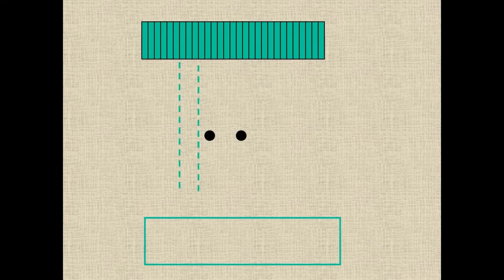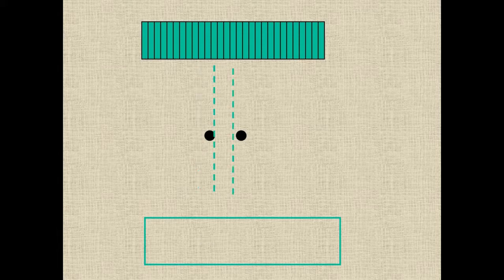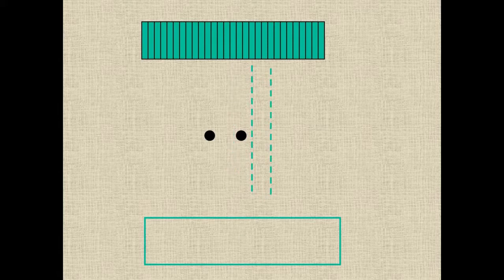If we narrow the beam width, we can then have a period of time where the beam interacts with one reflector, there's a gap between the two with no reflections coming back, it interacts with the second reflector and then moves on.